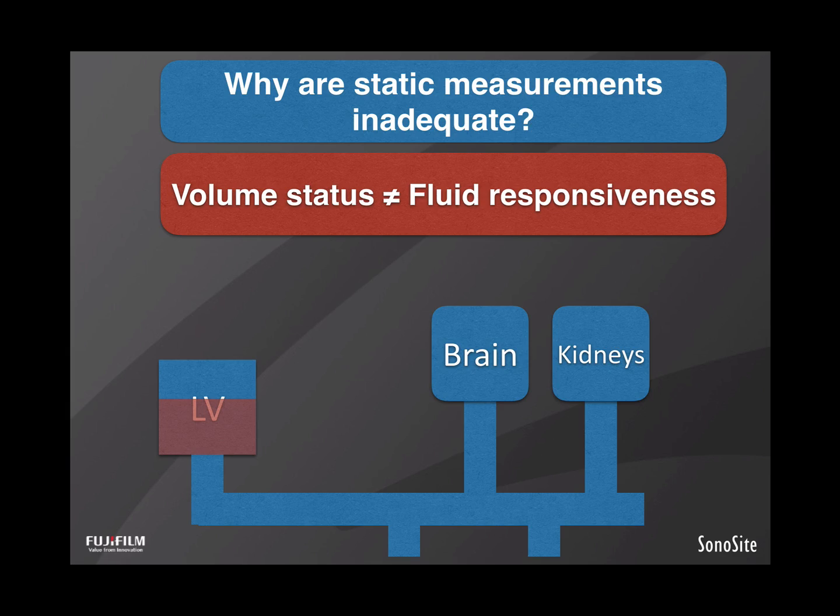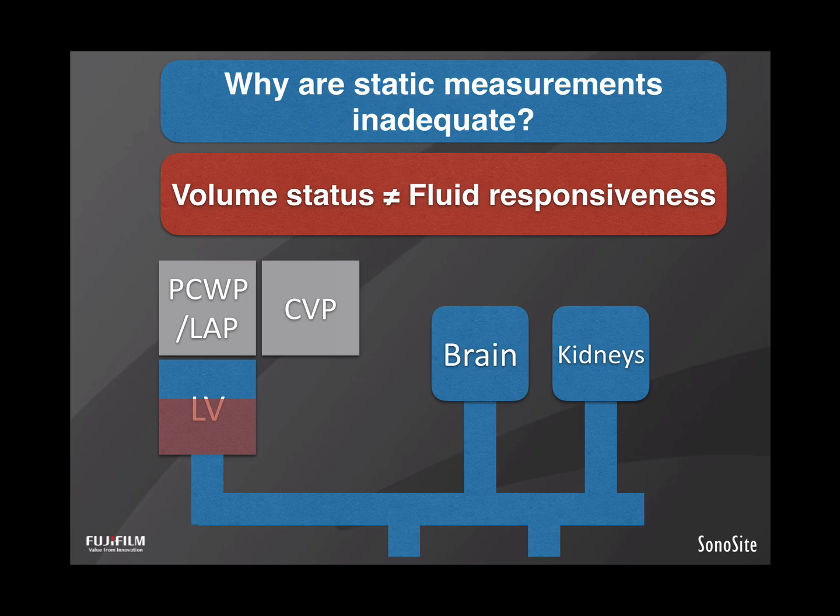Prior to the spread of bedside echocardiography, we used invasive measures of pulmonary capillary wedge pressure or the central venous pressure, which are proxies of LV preload. However, over the past decade, study after study has shown that the concept of volume status and preload are inadequate in terms of fluid resuscitation for the septic patient. There are many different reasons for this. One is that it doesn't take into account the systolic function or the vascular resistance. We couldn't really assess systolic function prior to the development of portable ultrasound imaging.